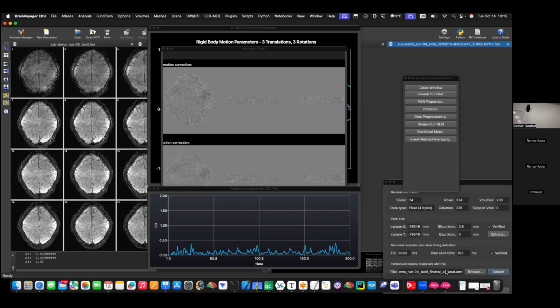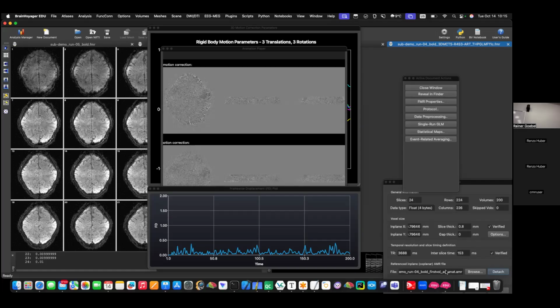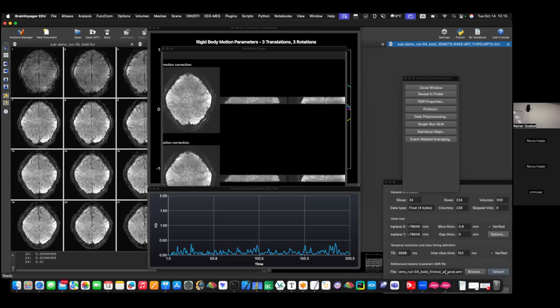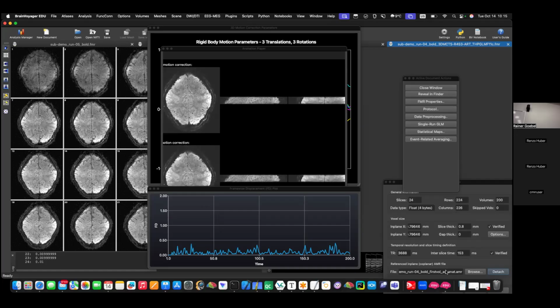Maybe you didn't run the right reference. The bottom line looks identical. So within run, that's the nice thing now, because if you go across runs in one step, from volume to volume, then the within run looks different a bit. Here we always do within run, which has fewer iterations, because you only have to align this volume to the reference volume, not to some far away run. So it's computationally more efficient, faster, and more precise, because we add the same transformation to all of these. Therefore, this looks the same, whether you do it to another run or not.